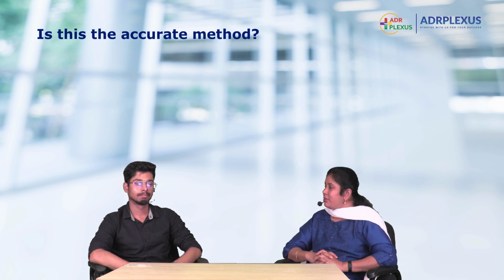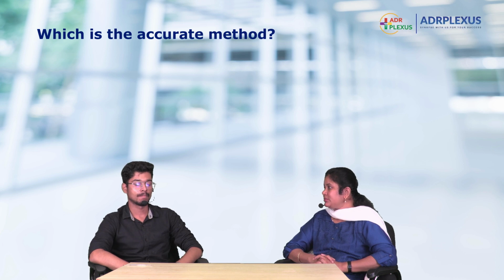Is this Sahli's acid hematin method an accurate method? I don't think so, ma'am, as it is subjected to observer variation. To me it may be matching, to you it may not be matching. So which is the accurate method then?